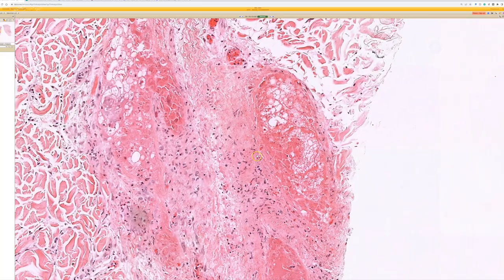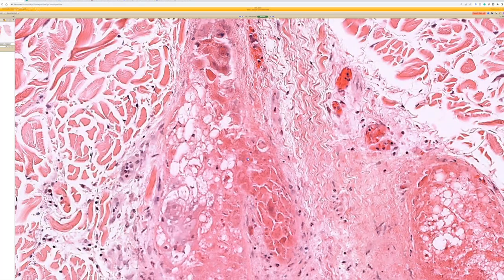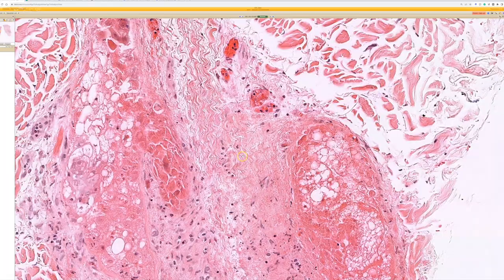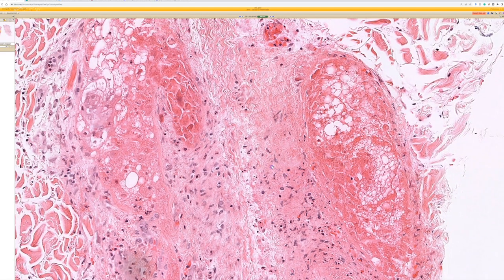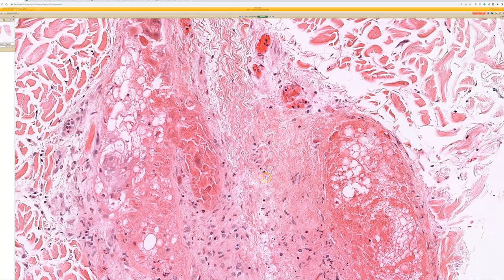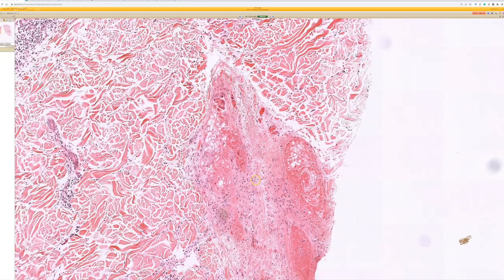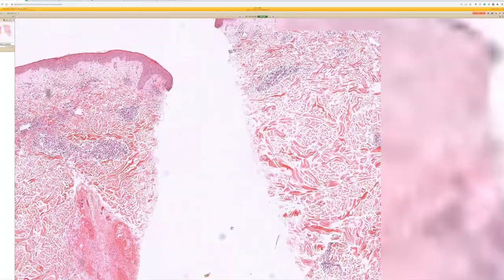Follicular necrosis is very good for VZV. The pattern of necrotic keratinocytes — even if you can't see good nuclear changes — is herpes until proven otherwise. If you can't find a convincing area, do the immunostain, which usually lights up even necrotic tissue and is very helpful. The immunostain is usually strongly positive if you have any doubt. So herpetic folliculitis is more common in varicella zoster.